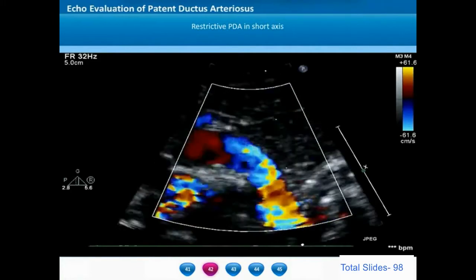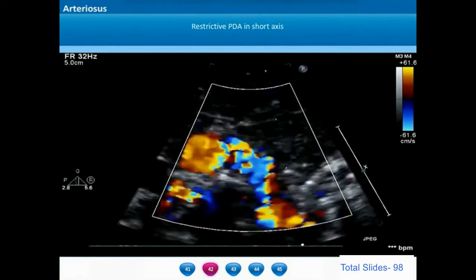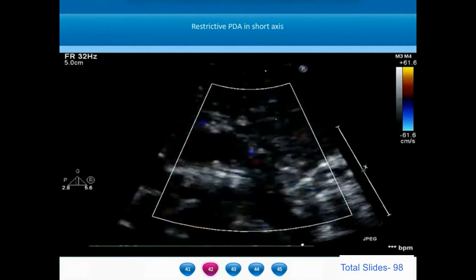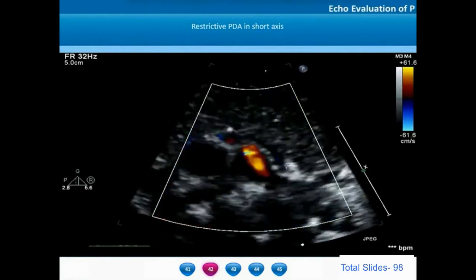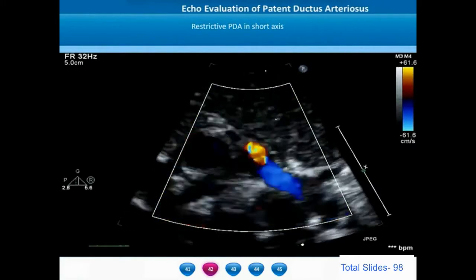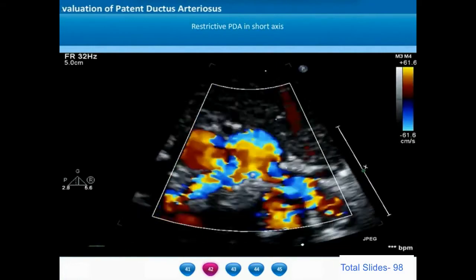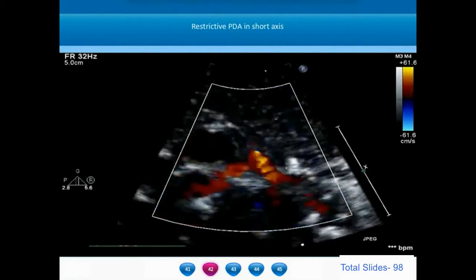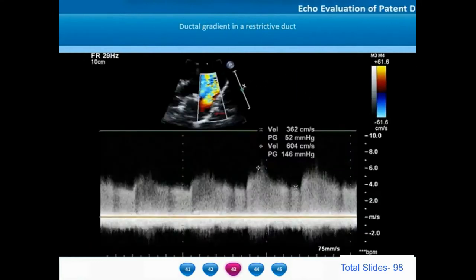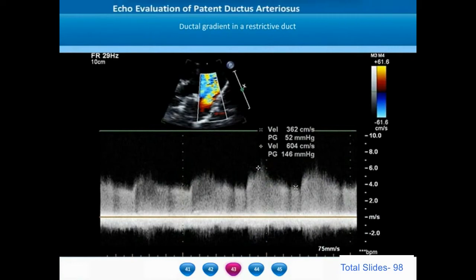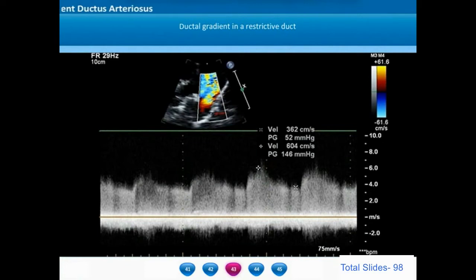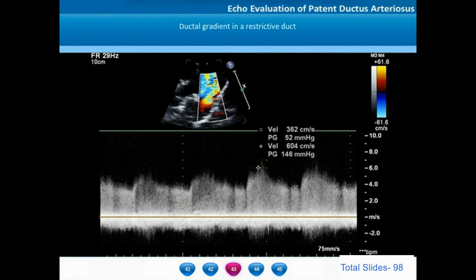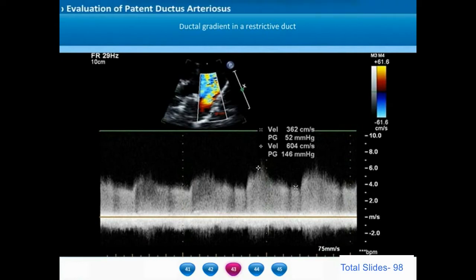On the short axis view, we notice the pulmonary artery bifurcation, and when we sweep the transducer a little bit more superiorly, we notice the origin of the small restrictive ductus arteriosus from the anterior wall of the descending thoracic aorta inserting onto the PA bifurcation. When we measure the gradients with continuous wave Doppler, the gradients are in the range of around 5 to 6 m per second — a feature of restrictive ductus because the pulmonary artery pressures will be normal. The end diastolic gradient is around 52 mmHg, which is also a pointer towards normal pulmonary artery pressures.